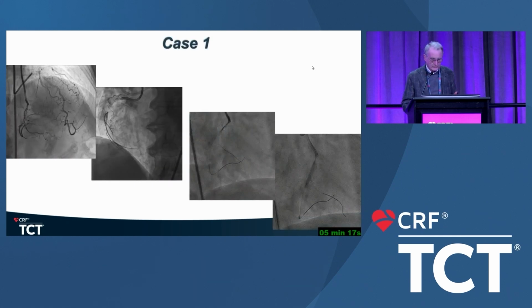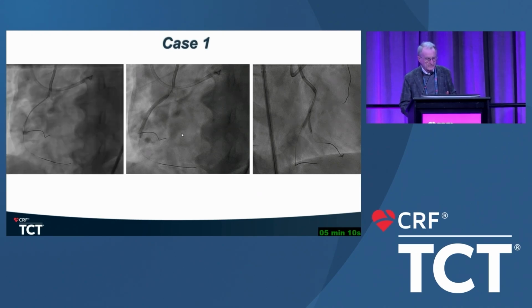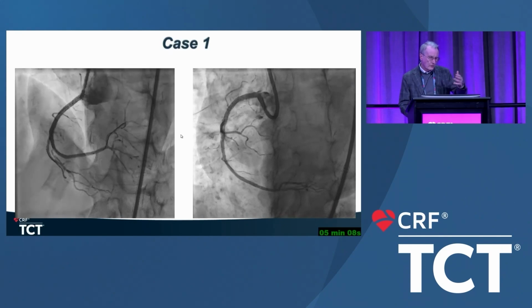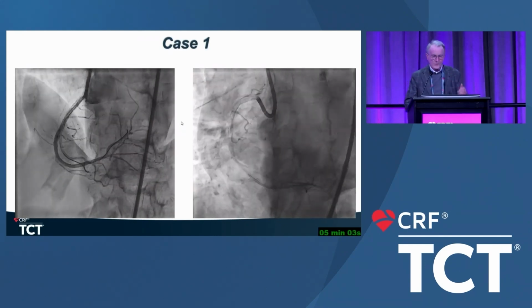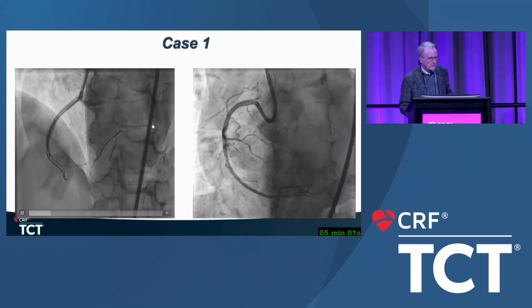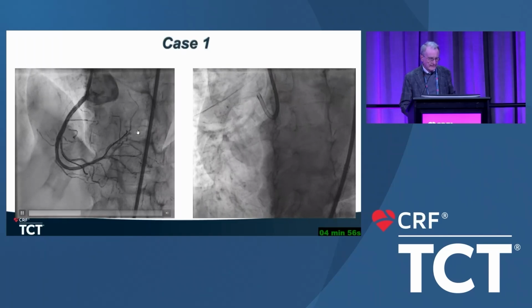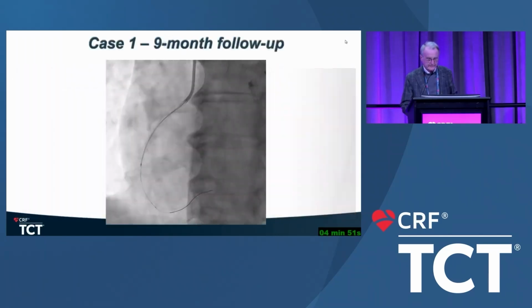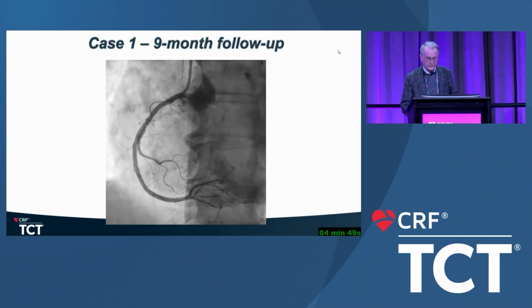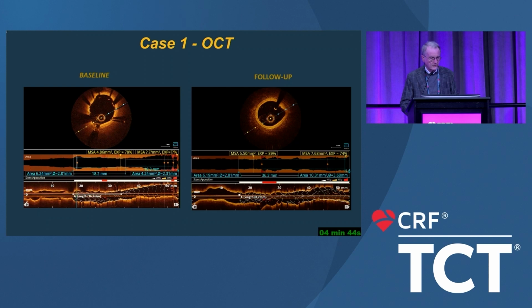This is a total occlusion of the right coronary artery, opened and did a lesion predilatation with a very old-fashioned technique. Personally, I don't use such a long stent, but I think we were a little bit confident that you can do a healthy-to-healthy approach. We implanted the long stent in this case. We did OCT, and let me go back to the follow-up.